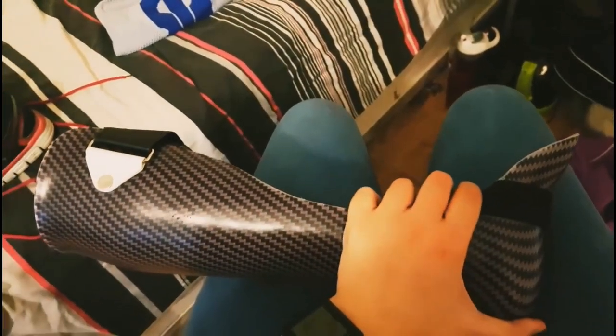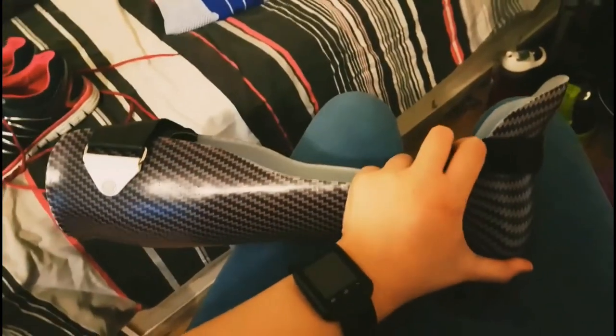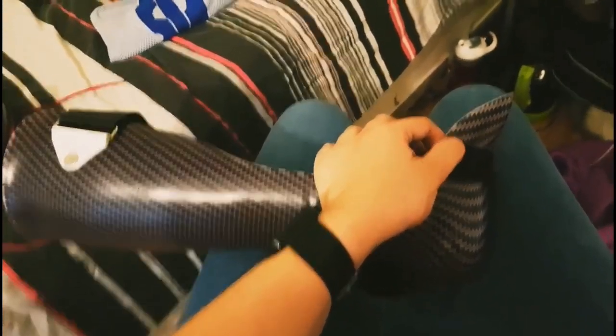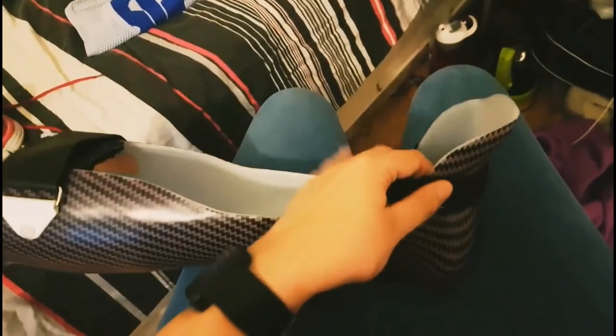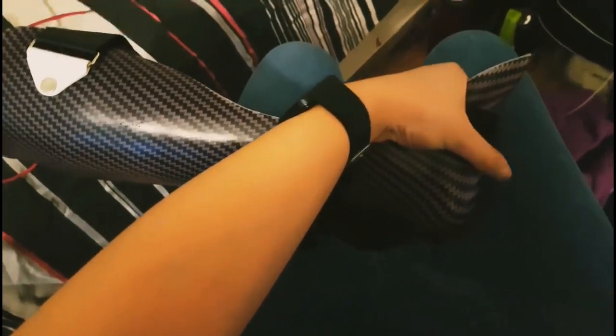These are designed to stop my knees from bending over backwards, or bending over the wrong way backwards. And basically this is all that is holding my ankle together. My consultant says that my ankles resemble two sacks of loose bones, and I got turned down for the ankle fusion surgery because of the EDS, so well, these things were sent to try us.